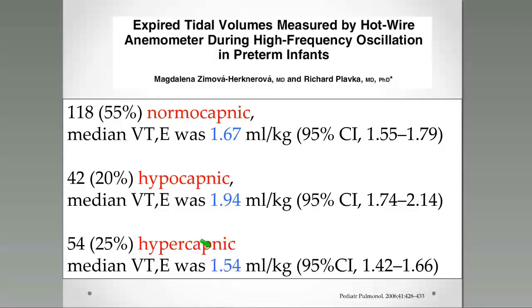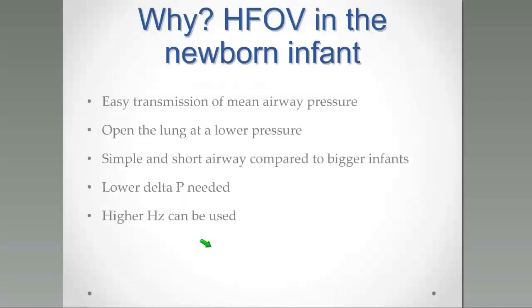And this is extremely important because, as you remember, the PCO2 influences brain perfusion a lot. And one of the risks of using very powerful ventilators is that we can decrease the brain perfusion due to hypocapnia. So monitoring of the tidal volume is going to be very essential and very important right now in the use of HFOV. So let us move to the very clinical approach.